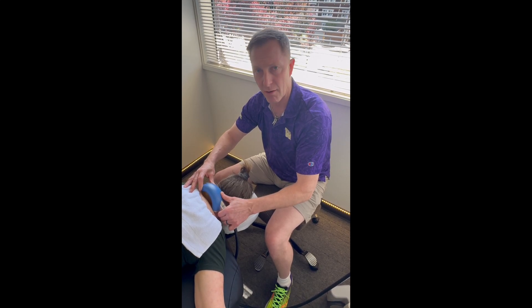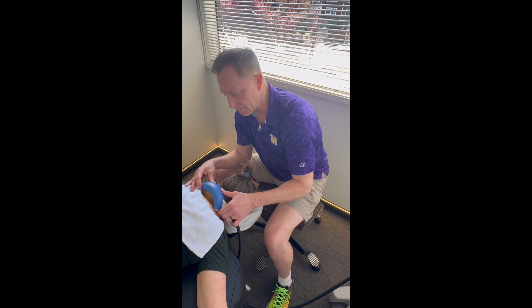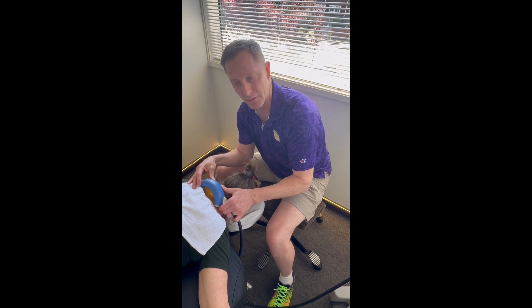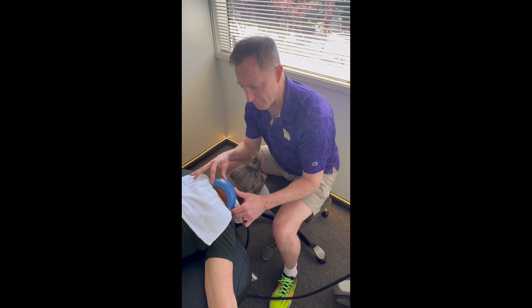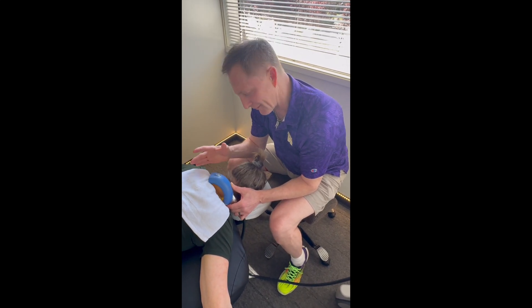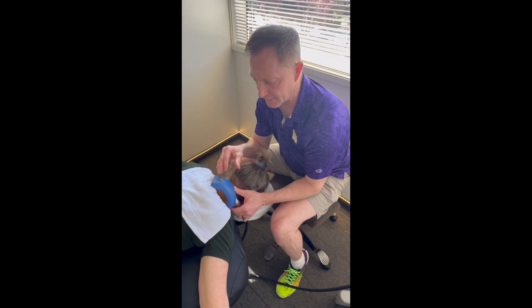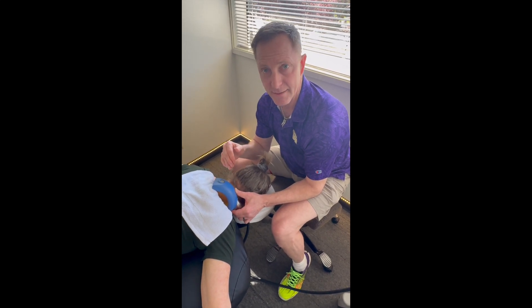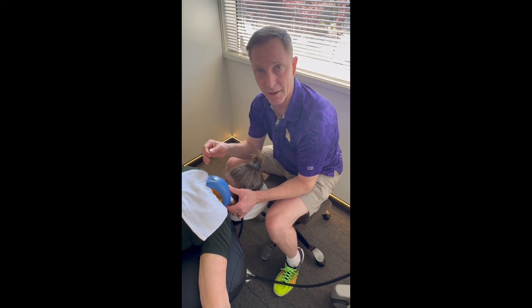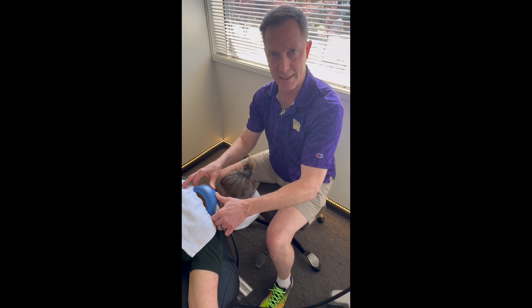So for those people who have advanced chronic problems that are very difficult to treat, that's why we brought this machine in — to address those things more directly with less hands-on effort. The problem is, even with the strongest hands, a therapist will fatigue within about five minutes. No one can give this kind of deep tissue release for this duration manually. As the patient said, it goes right down to the bone — she feels immediate relief, like it's doing something exactly where she needs it.